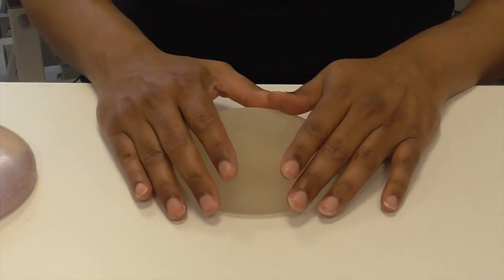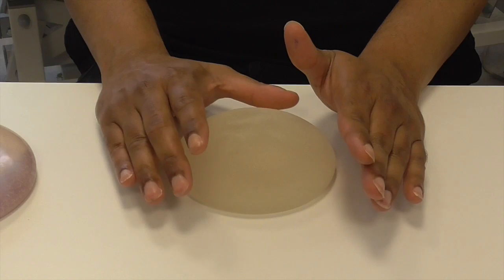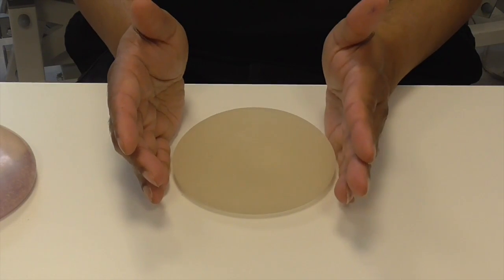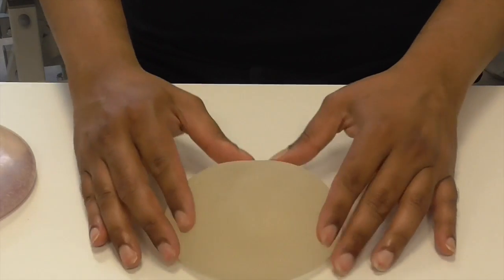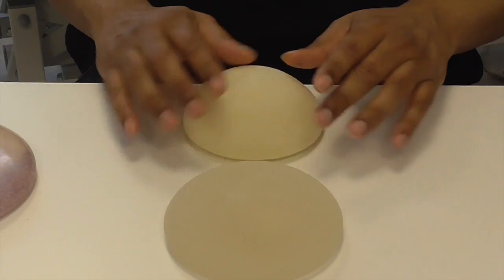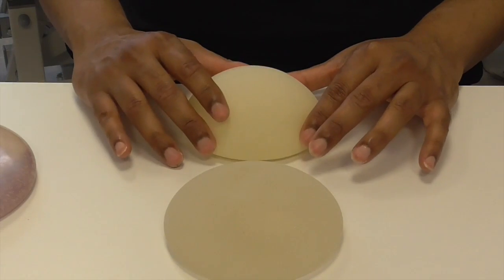However, with the silicone shell being smooth, there's about a 40 percent chance of something called capsular contracture. To reduce that, there are two types of innovations: one is the texturing and the other is to coat the silicone shell with something called polyurethane.